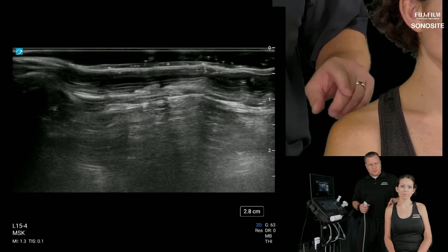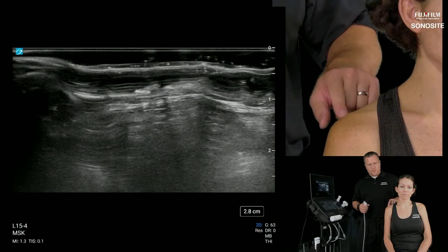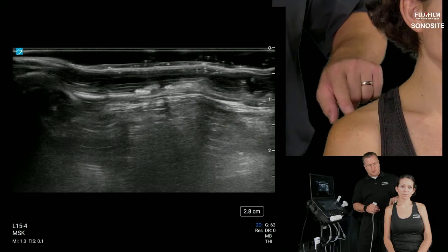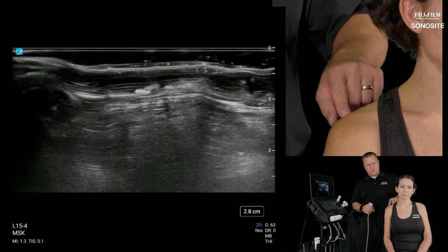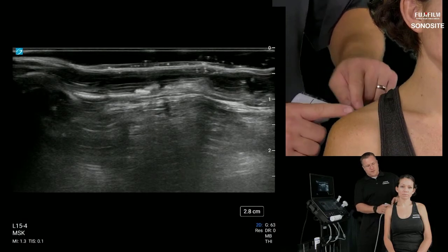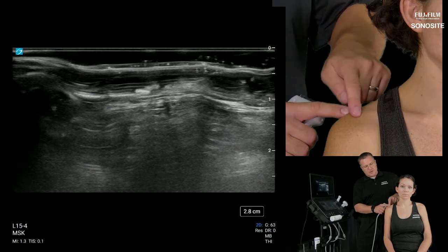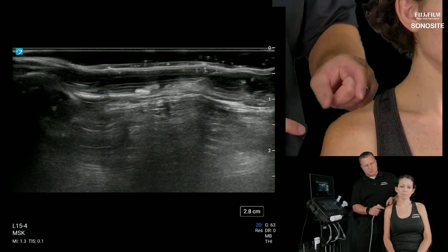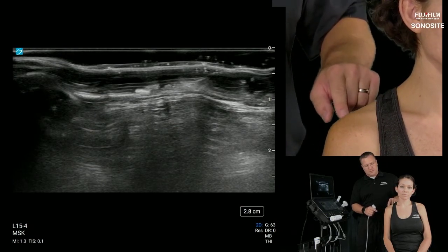On most patients, you can start at the scapular spine and work your way forward until you can't feel anything else. So right here, I'm just walking my fingers until I reach a bony stopping point. At that point, the acromion is taking a slight turn, and the clavicle is meeting it at that turn, creating the AC joint. So we should be able to set the probe right down in front of where I feel the spine of the scapula stop.